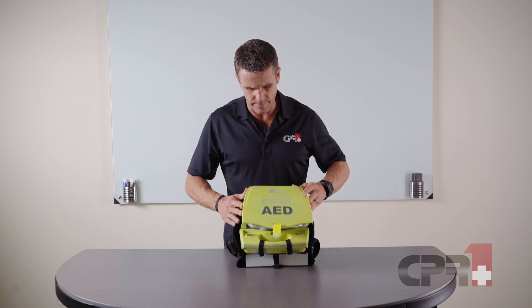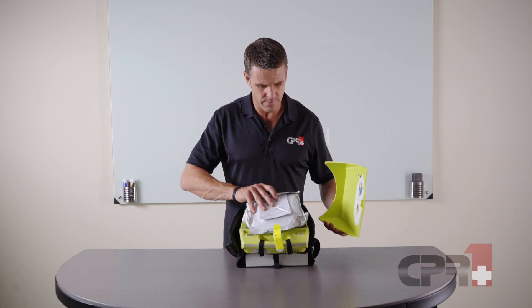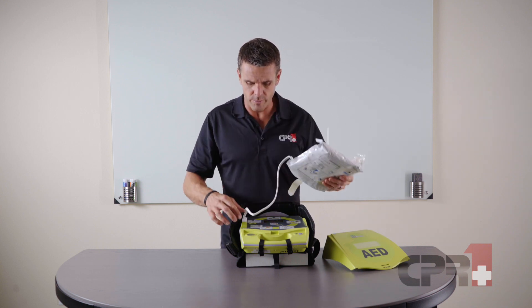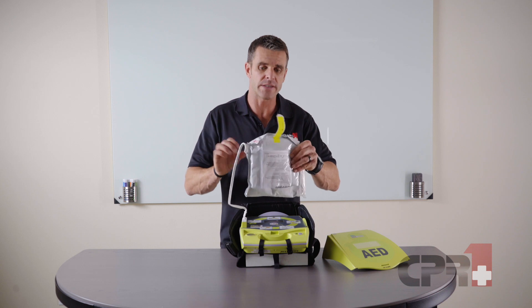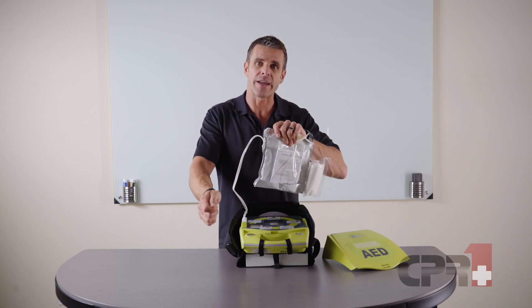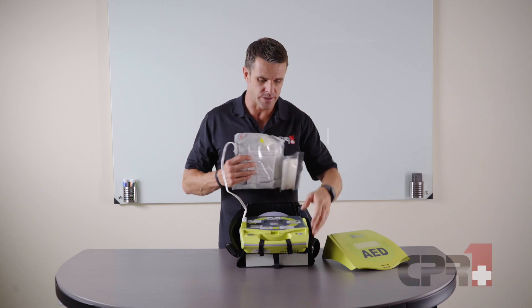When we open it up, we have the adult pads ready to go, pre-connected. The device goes through a quick self-test letting us know it's ready, and then we tear these pads open and place them onto the patient.